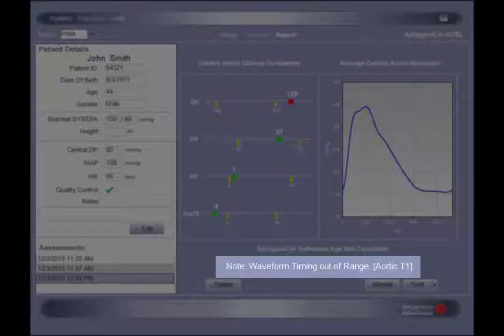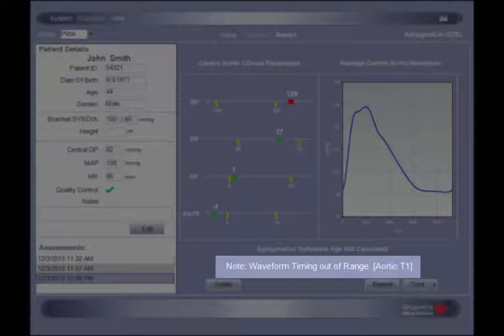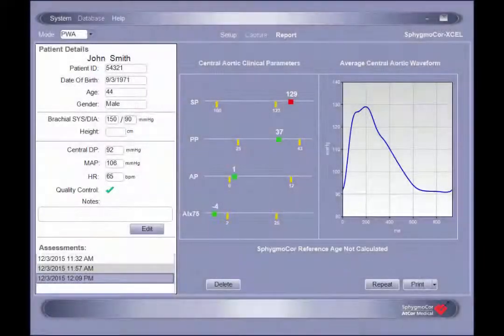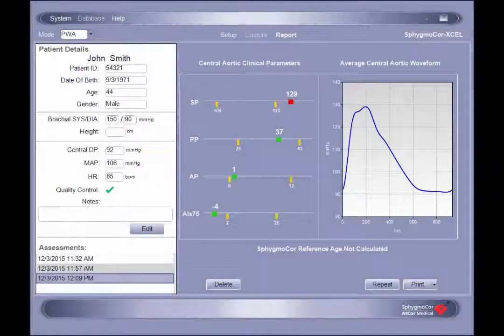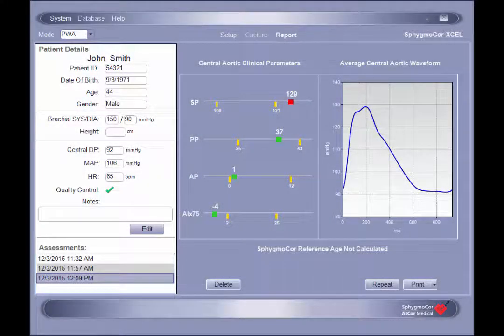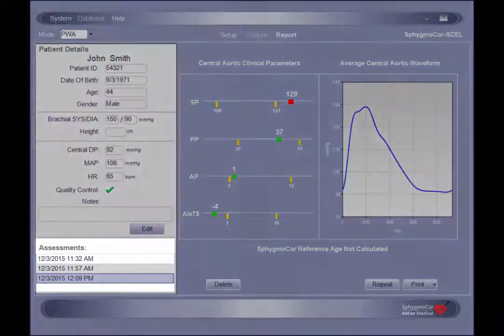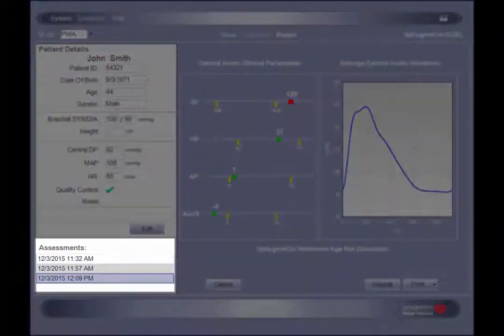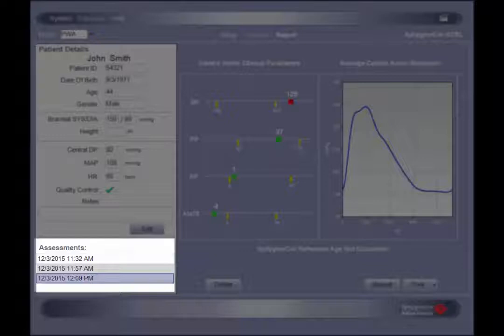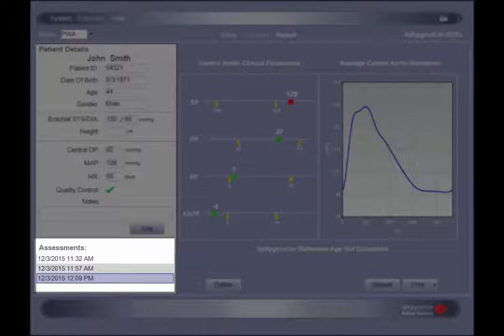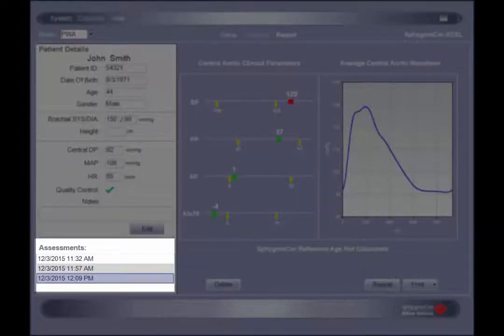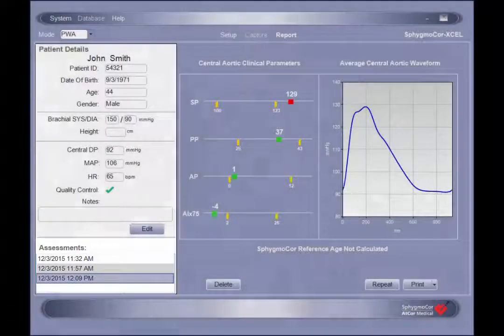For further information about a specific note, please contact an AtCore medical representative. Once generated, a report is automatically saved to the patient's profile. Any subsequent reports will also be added under the patient's profile and can be accessed in the assessment section at the bottom left of the report screen. All reports are listed chronologically and identified by the date and time of the assessment.